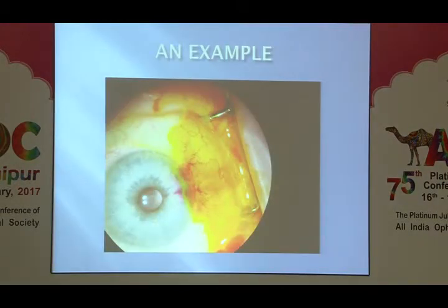Right, this is a finished hybrid trabeculectomy. As you can see, there is absolutely no leak from the wound point. You can test it with fluorescein, and you can see that the bleb has been burped, and there's a very good bleb on the top.